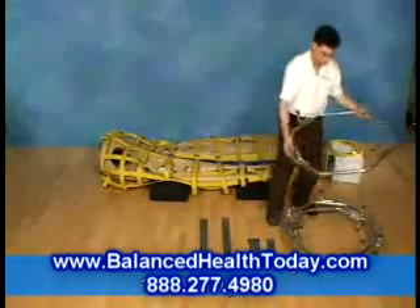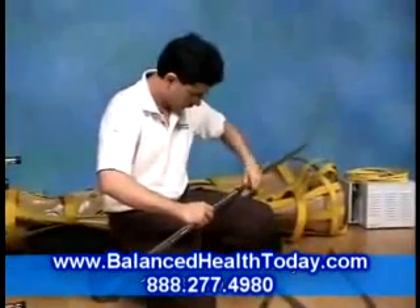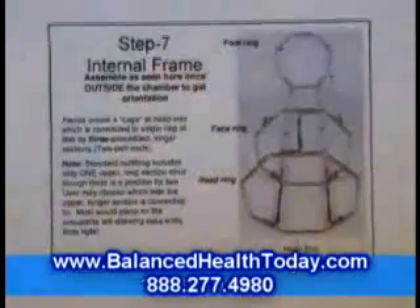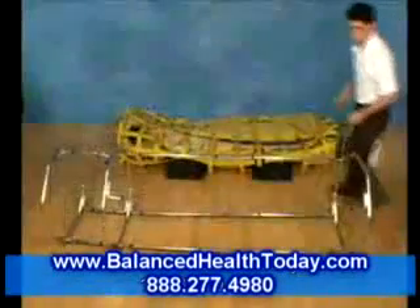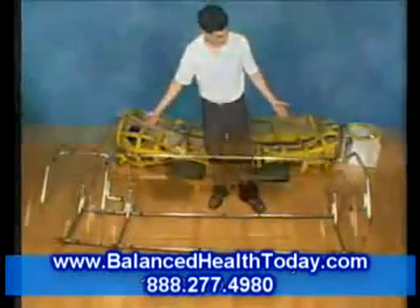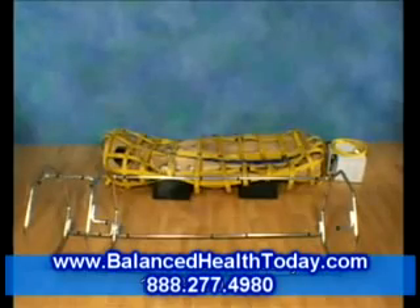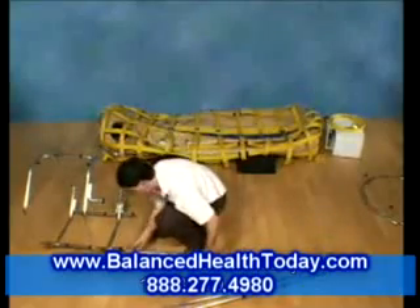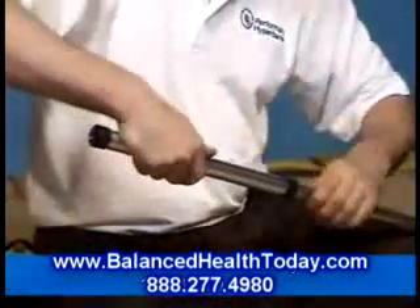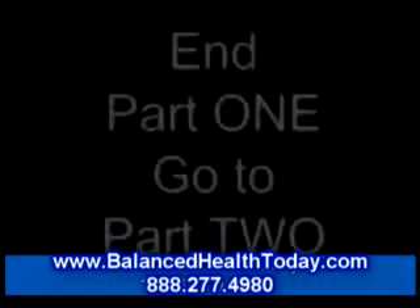Now let's put the frame together. Assemble it outside the chamber first to make sure you correctly understand how it goes together. If you've followed the instructions in the manual, it should look like this: with three circular rings, two long rails across the bottom, and a long rail across the top. The rails have support sleeves in the middle. You should also have a spare sleeve and two spare rails, which will not be used today.